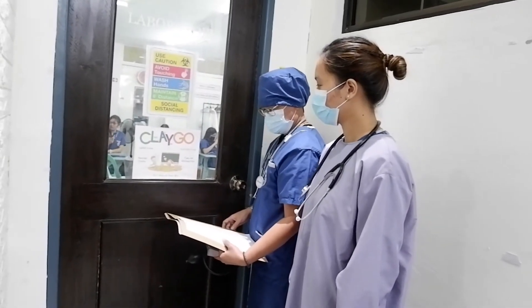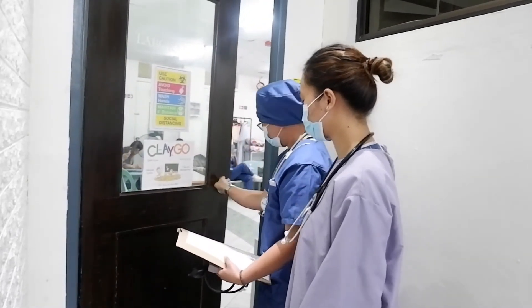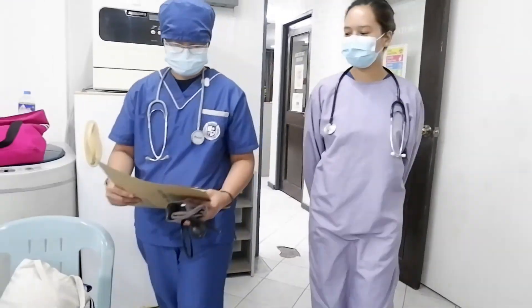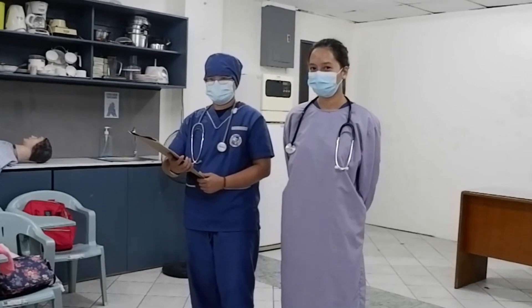The first thing we need to do is knock on the door three times for courtesy. After entering the patient's room, tell the patient what you are going to do.